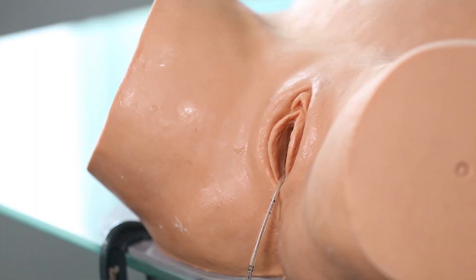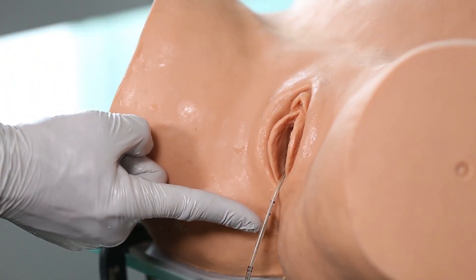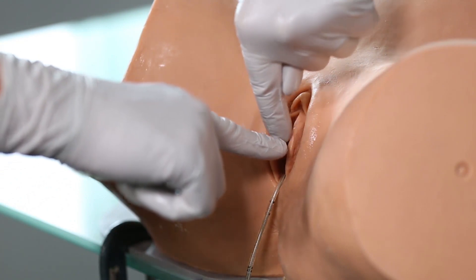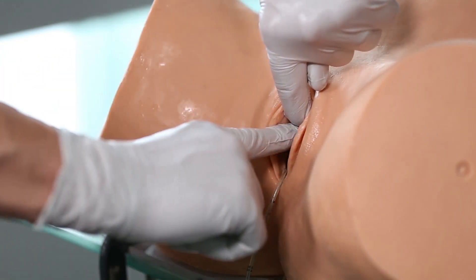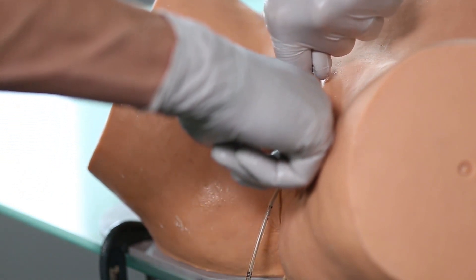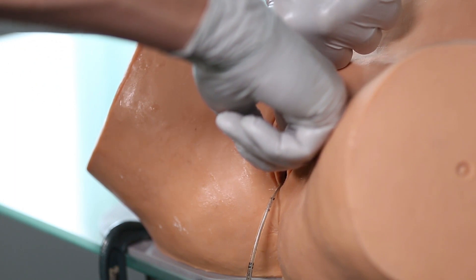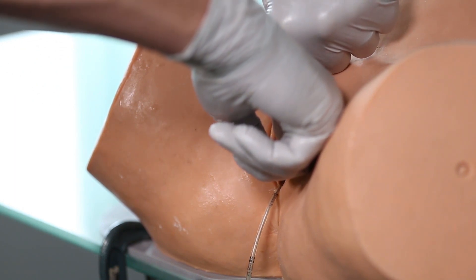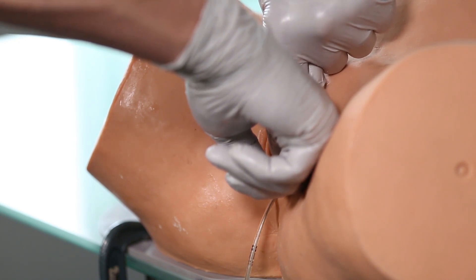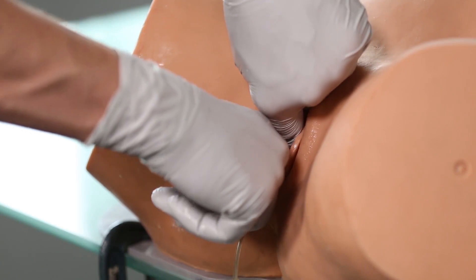Step number three is to maneuver the cup to the predetermined distance, which in this baby was eight centimeters. I insert two index fingers — the superior hand holding tissue up and out of the way, the inferior hand right up on top of the edge of the cup and pushing downwards. As I push down, you can see the stem shortening. I'm now at the six centimeter mark and I continue to push — there's seven centimeters, and there's eight centimeters.